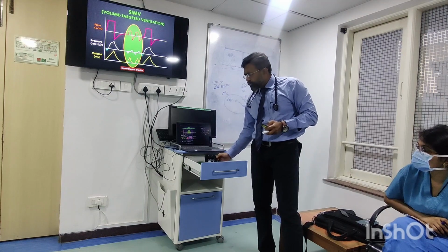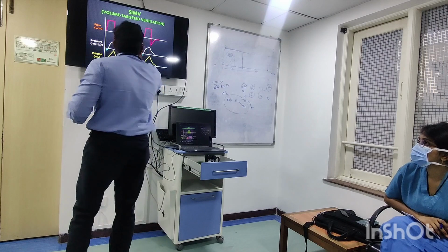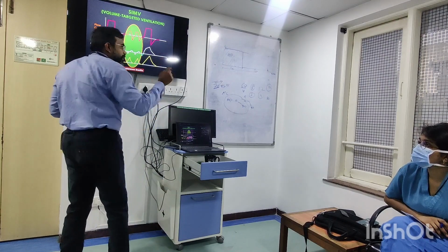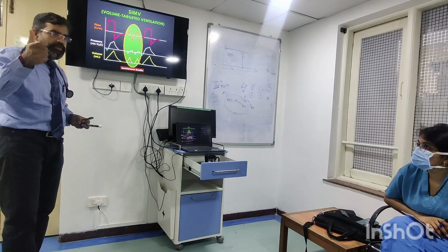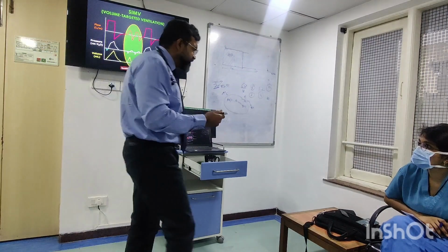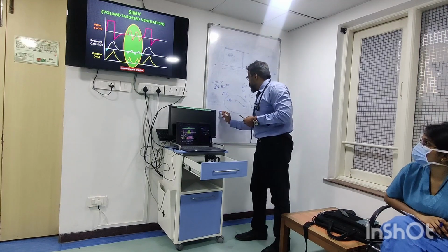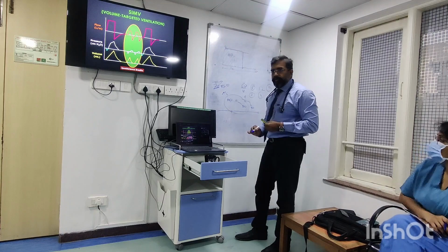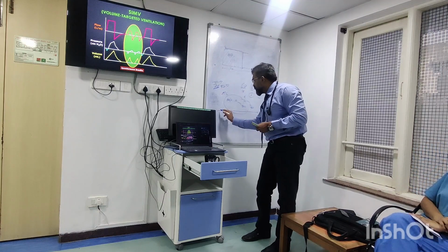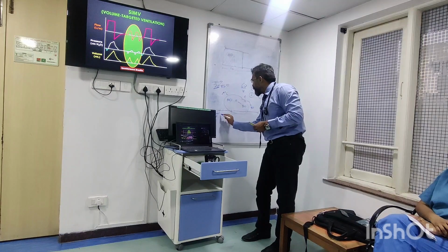Now, how this is determined, why did this spontaneous breath come here, why not here, that is dependent on each ventilator's software. Okay, that depends on each ventilator's software. For example, what is the software in the existing ventilators that we have? We have, the breath is divided into two parts, inspiration and expiration. In inspiration, there is a SIMV period and a mandatory period.